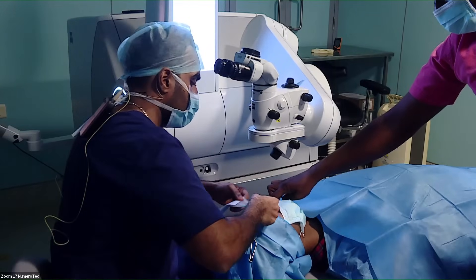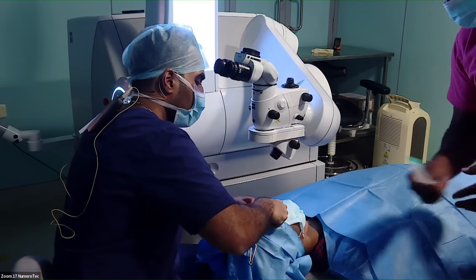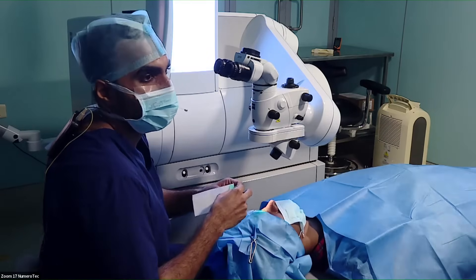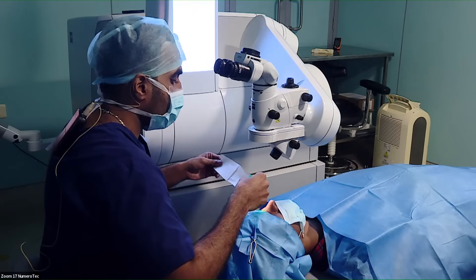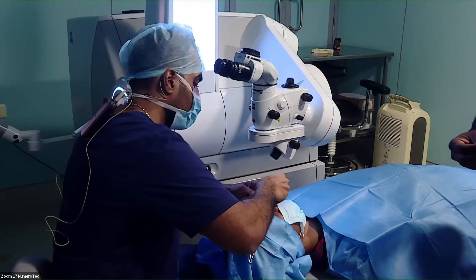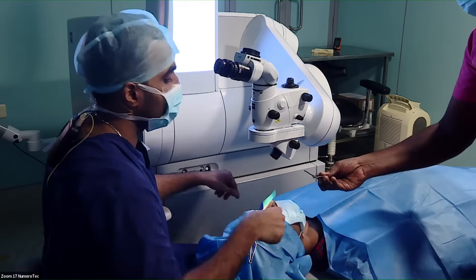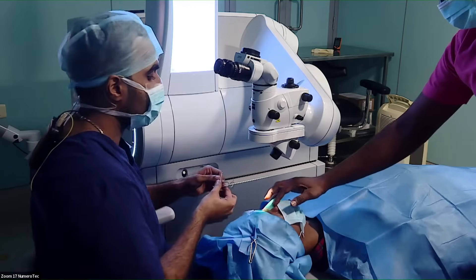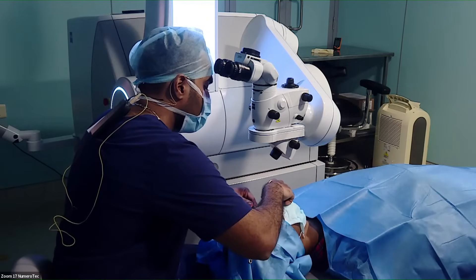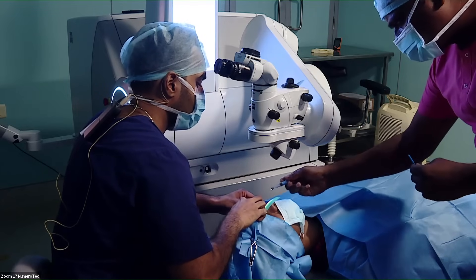In case of complications like OBL, how would you handle it? OBL doesn't really happen — OBL might occur if your energy settings are too high. Right now I'm operating on lower energy settings. Lower energy settings and wider spot spacing lead to quicker recovery, but the trade-off is that the dissection is not as easy as it would be with higher energy settings and closer spot spacing.